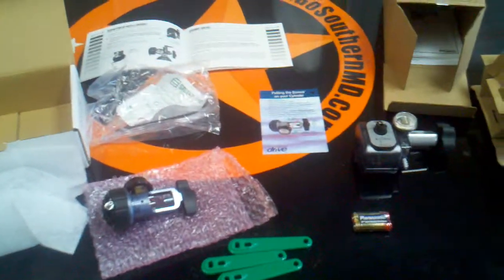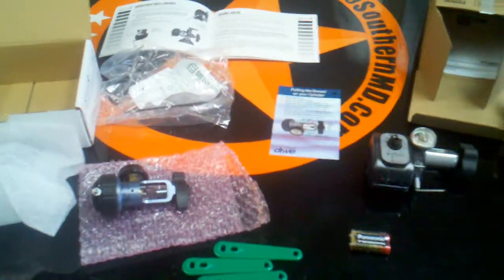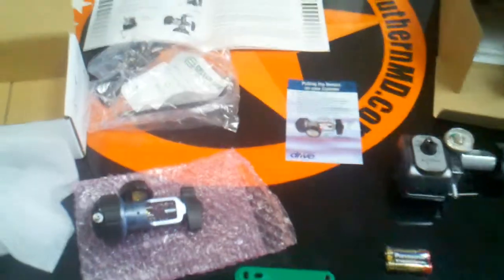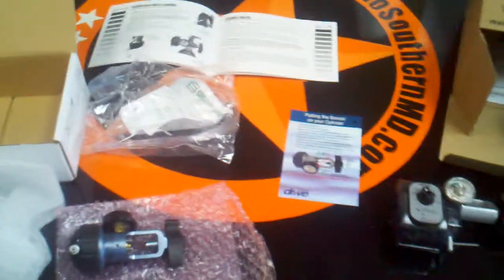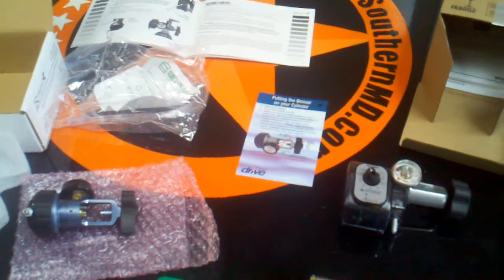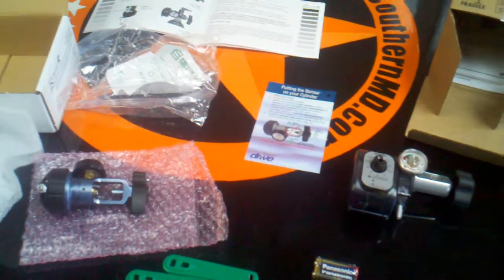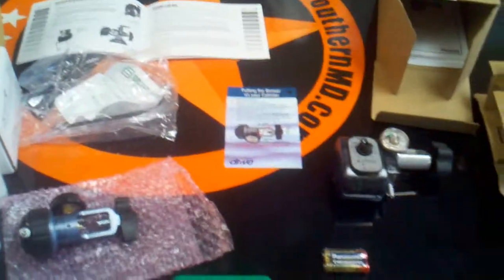Hello, this is GoSouthernMD.com and today I'm going to be showing you two conserving devices and just the differences between the two and the kit it comes in, so that way you can make the right decision on what conserving device you want to get for your portable oxygen tanks. This is the DeVilbiss Pulse Dose.